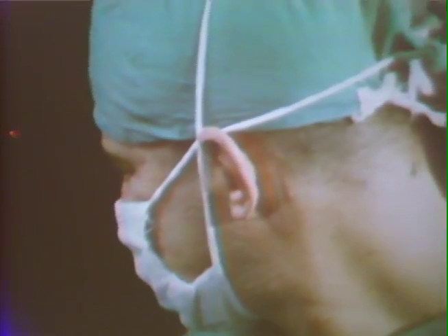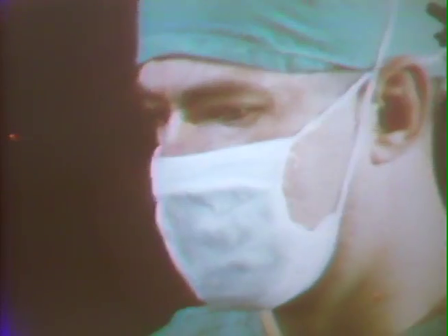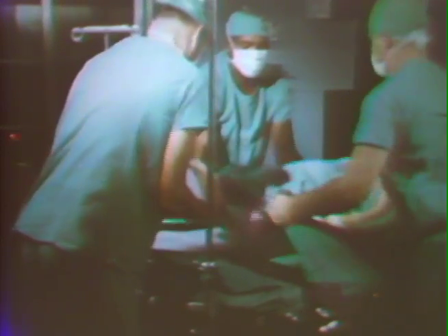Constant, unrelenting monitoring of pulse, blood pressure, respirations, surgical procedure, and equipment is absolutely mandatory. The operation completed, the patient is carefully moved to a stretcher and taken to the recovery room.